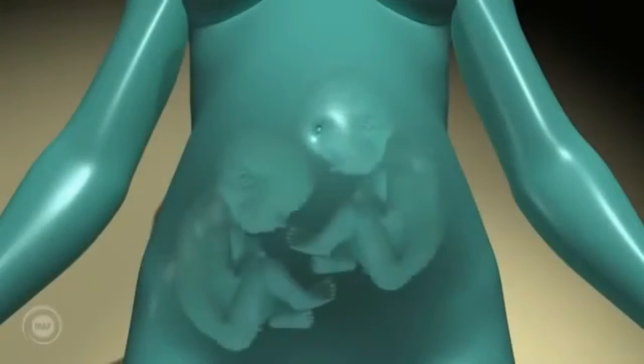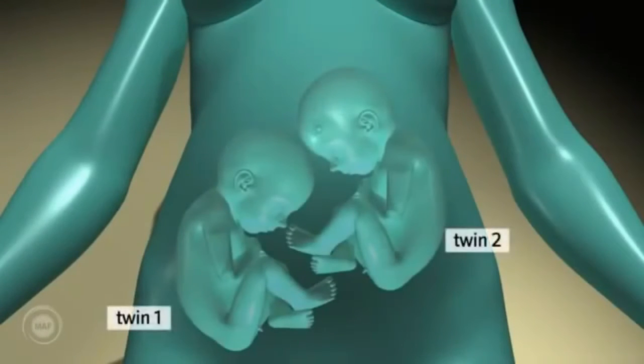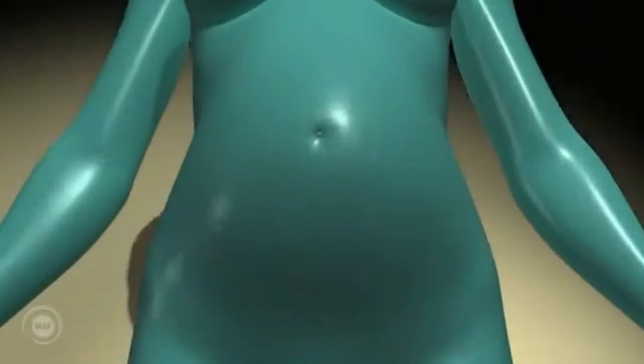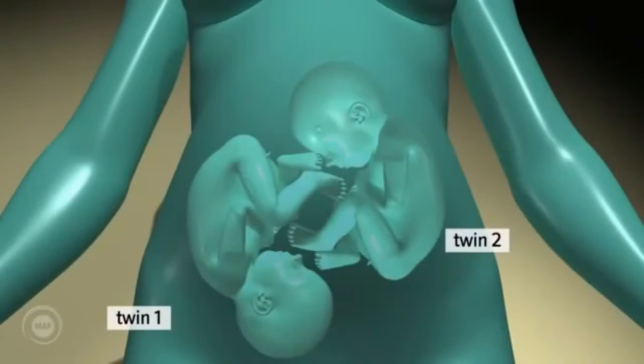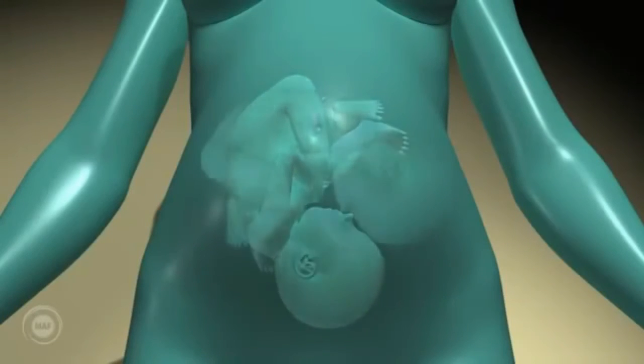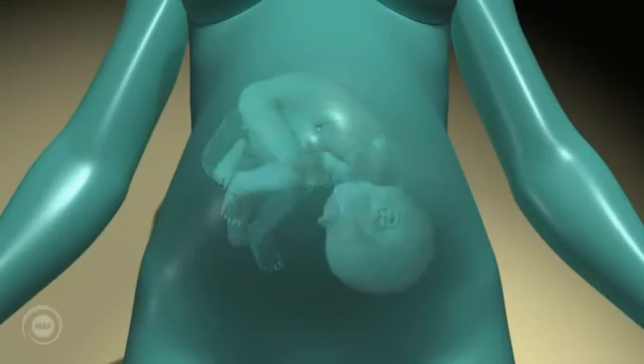In the case of breech twins, the same principle applies. The twin with the lowest most breech will be described as twin 1. Clearly, in some instances, twin 1 may be cephalic and twin 2 may be breech. The lie of the twin refers to whether the twin is in the longitudinal, transverse, or oblique position.